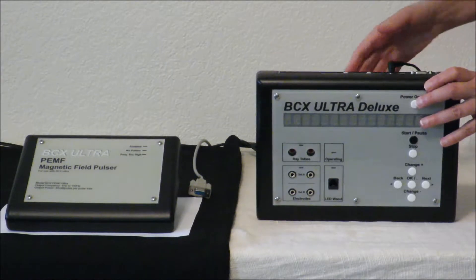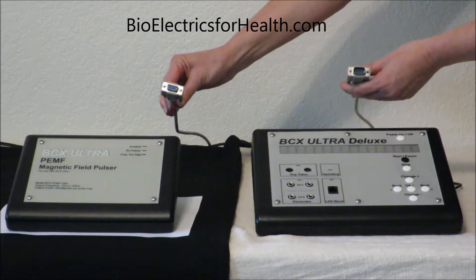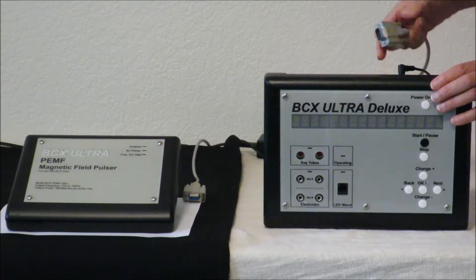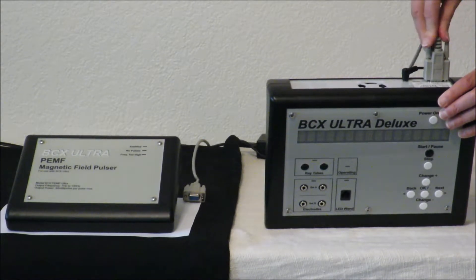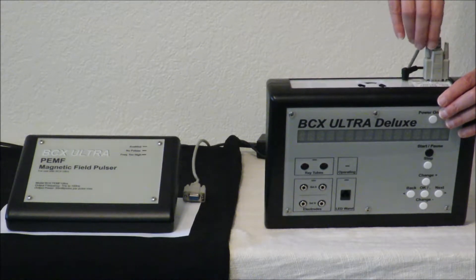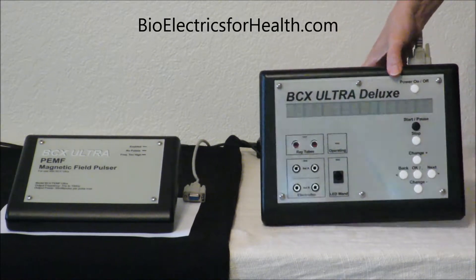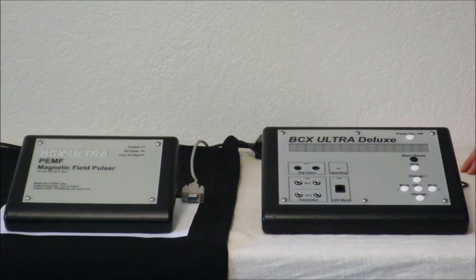You have this gray cord that connects these two units together. They have different ends and different pins on the fittings. We're going to hook up the BCX Ultra Deluxe portion first. Put the plug in — it has two screws that hold it in place. It is best if you tighten each side a little at a time until it is very snug. Now your power cord that's going to run to the PEMF device is connected, and you have power to your BCX Ultra Deluxe.